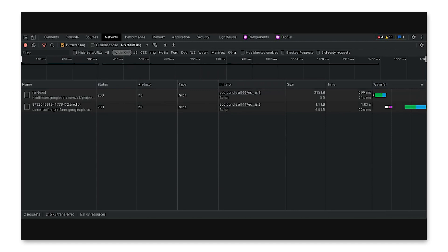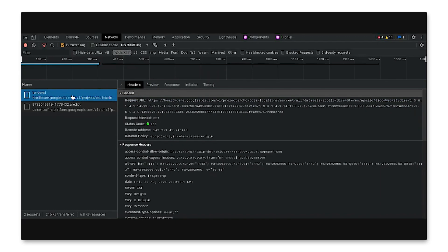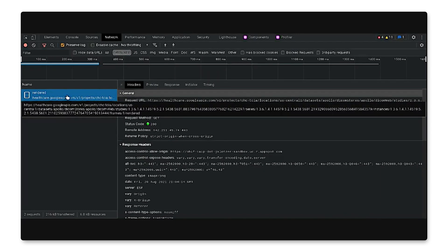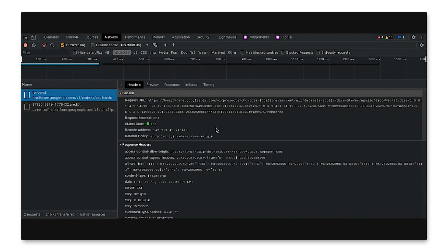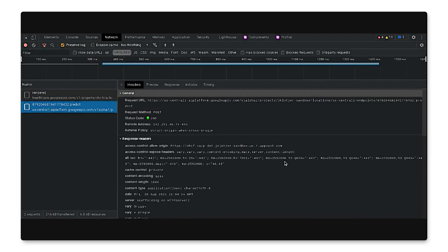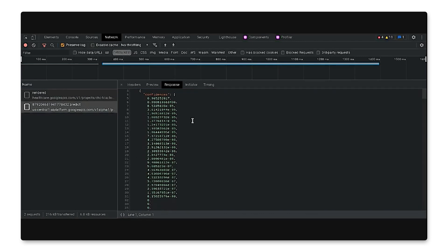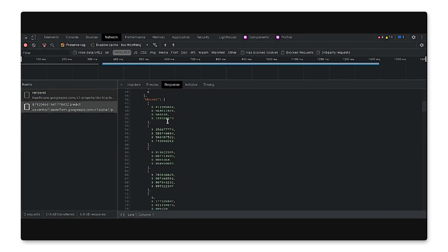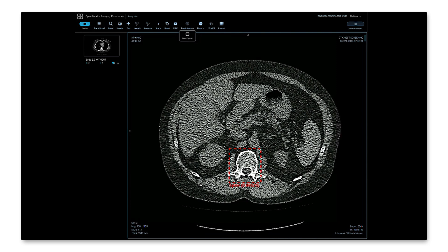We can also take a look at the JavaScript console to see what's going on behind the scenes when we hit Find Spine. There are just two API calls. The first API call is a render request to the Cloud Healthcare API, which we use to get a rendered view of the image. The second API call is to an online prediction endpoint hosted on Vertex AI — this is what we use to predict whether or not there's a spine in the image. The response we get back includes confidence scores, as well as bounding box information for the spine detected. In the end, OHIF renders the image as well as the bounding box on top of the image.